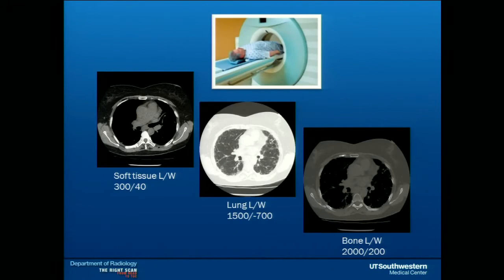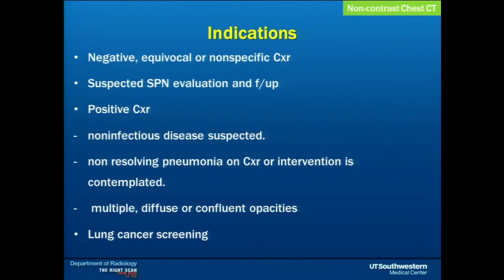So this is a slide which is showing the patient entering into the CT gantry. And we can see the importance of CT in this image is in the inferior portion of the slide, which is showing not only the lungs but also the mediastinum and the bone. And evaluation of mediastinum is important in terms of evaluating lymph nodes, aorta, and pulmonary artery. And at the same time, you can look for any bone lesions and lung lesions.